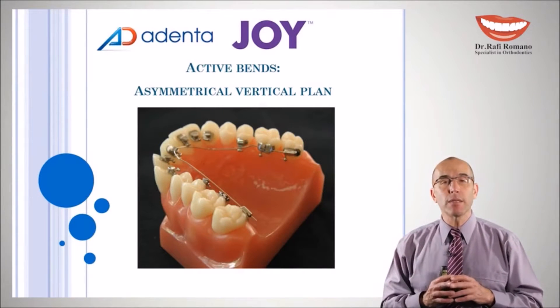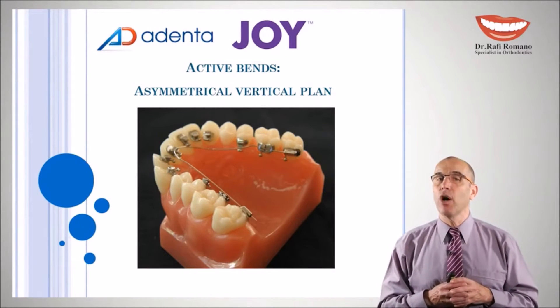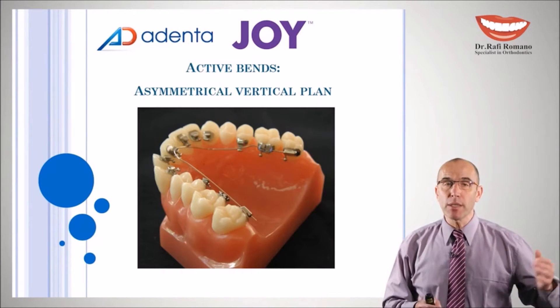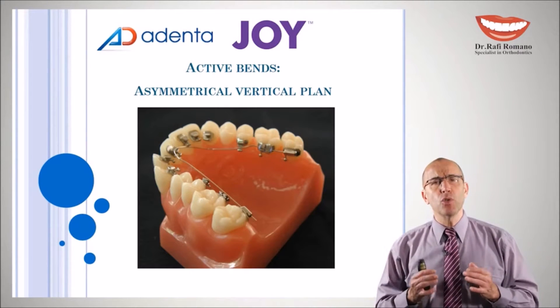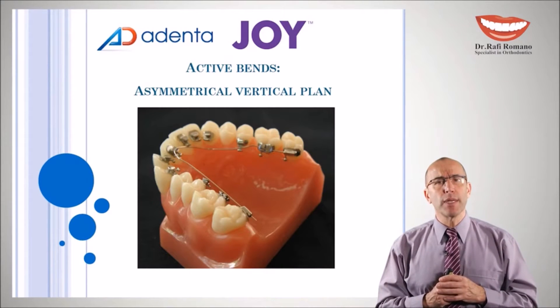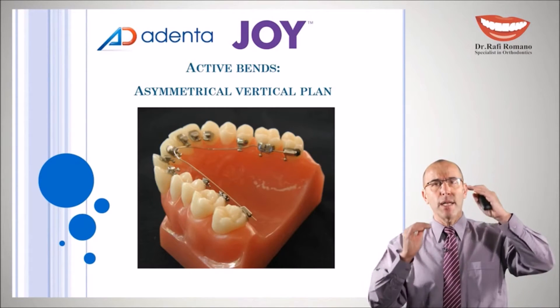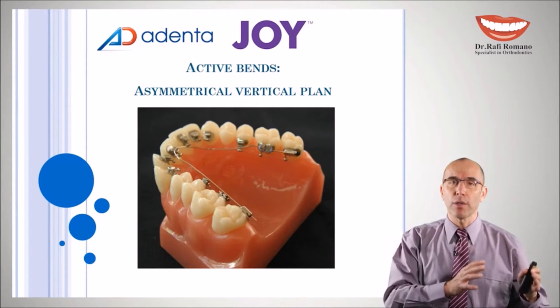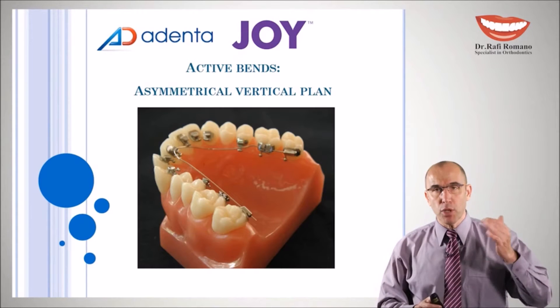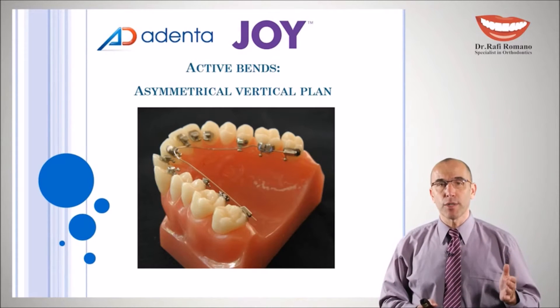The last two bands are quite complicated and not very common in our treatment sequence. They are designed to do an asymmetry correction. The asymmetry can be vertical or horizontal, and we will demonstrate both options.